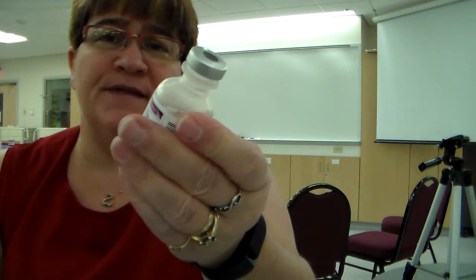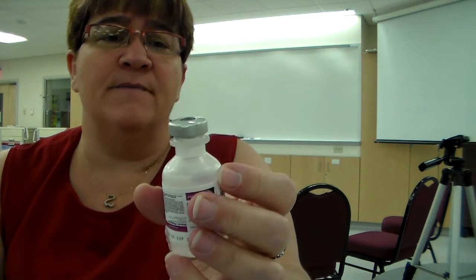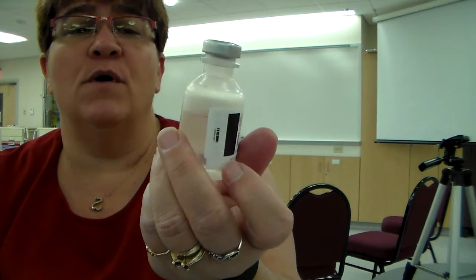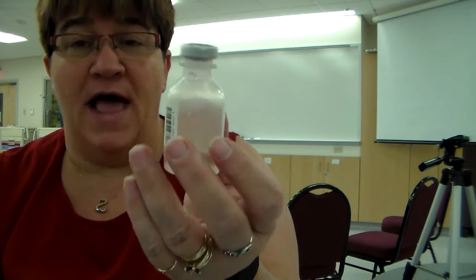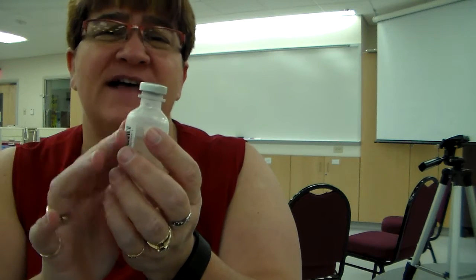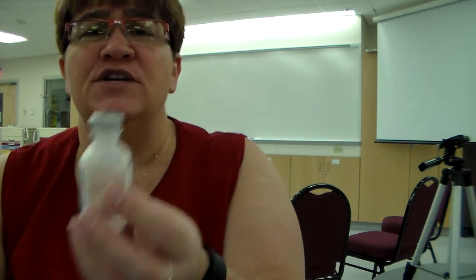If you were to drop this, you would have to look and say, oh, a lot of bubbles, so be careful. Or if it was a glass bottle, you wouldn't want to use it, because you could actually have broken off minute pieces of glass inside. So you would discard that and get another medication. So there, you learned.